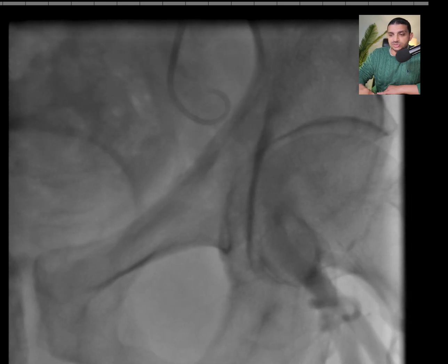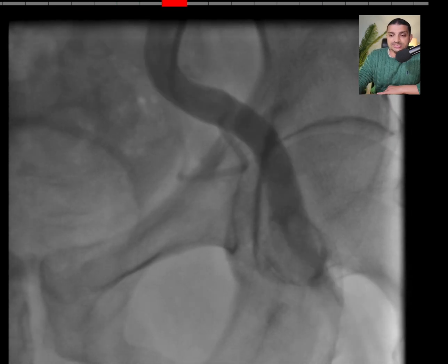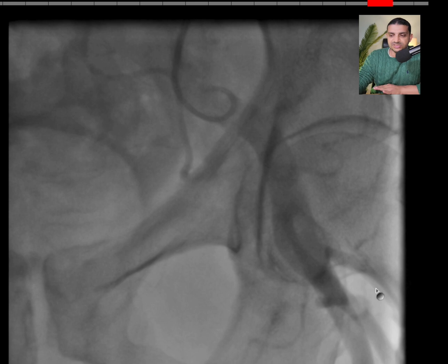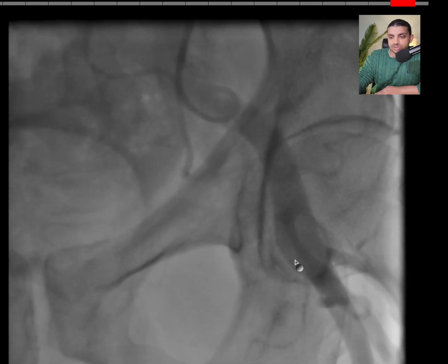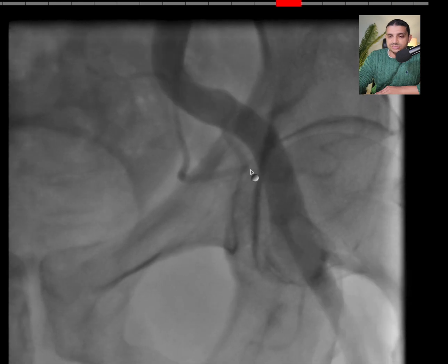The most important thing, as you can see here in the hand injection, is that you do not pan. You fix the table and you don't pan. Where you target is this bifurcation as you can see, and up here is the inferior epigastric — this is where you're going to puncture.